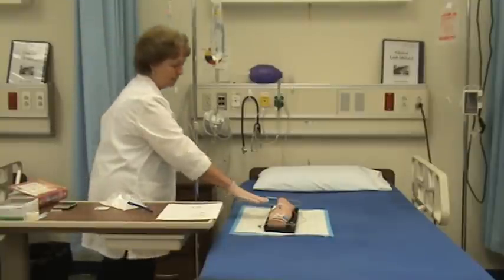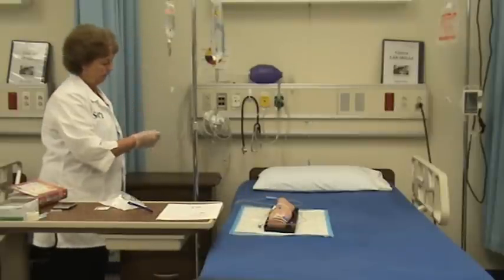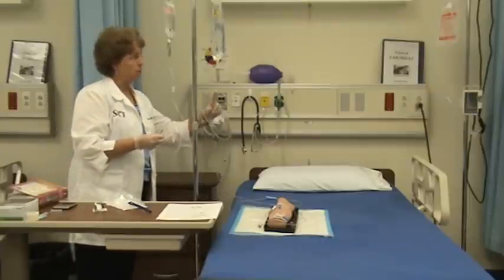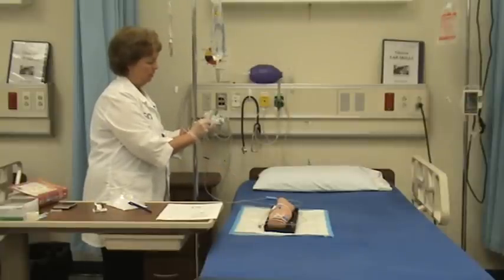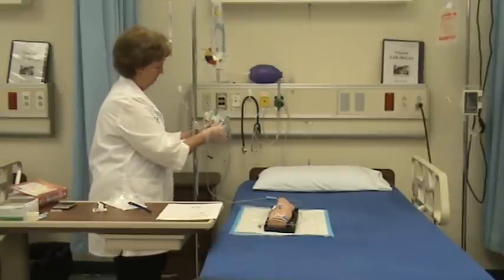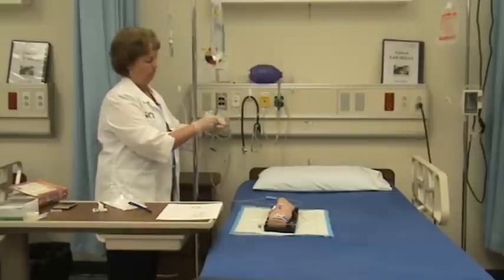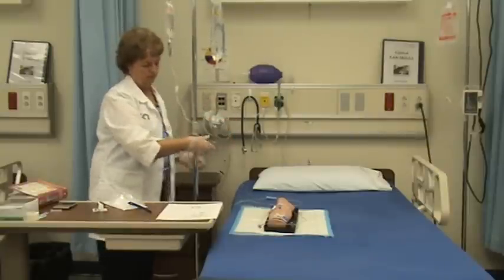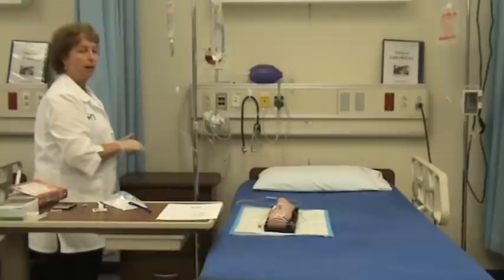I've assessed the IV site to make sure it's patent with no infiltration or phlebitis, and I clean off the port. When giving an IV piggyback you want to go to the port closest to the bag, whereas IV push uses the port closest to the IV site. I'm going to clean with alcohol. This is a luer lock so I'm just going to screw that in.